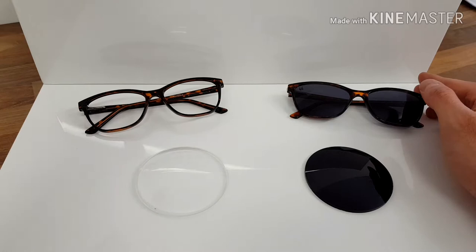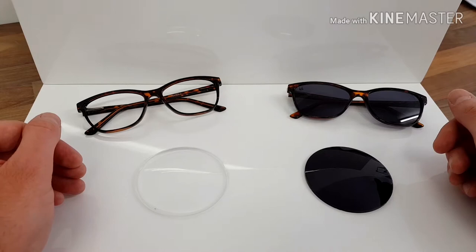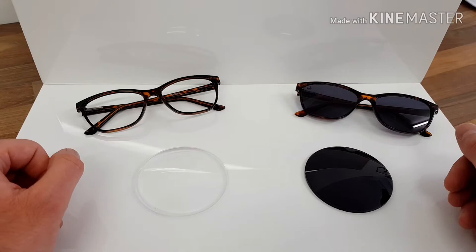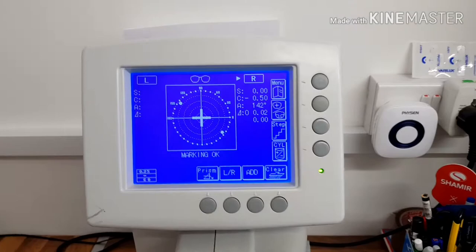Hi guys, Colin here from Precision Optics Eyewear. I'm going to do a quick video to show you how I'm going to transform a clear optical frame into a pair of prescription sunglasses. This frame we normally sell just as clear for normal use, but we can make it into prescription sunglasses, which can help cut the cost down a little bit. These are normally £28 with stock clear lenses, and if you want them with stock tinted lenses in your prescription, they're £46. So it's not a bad price.